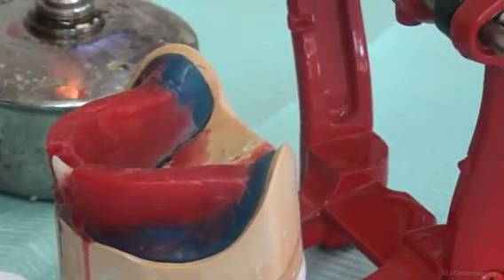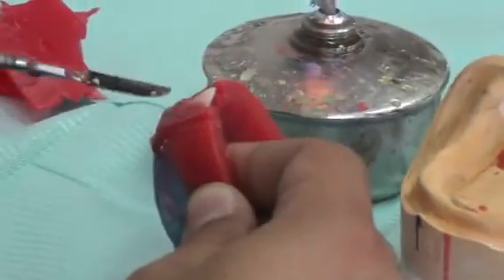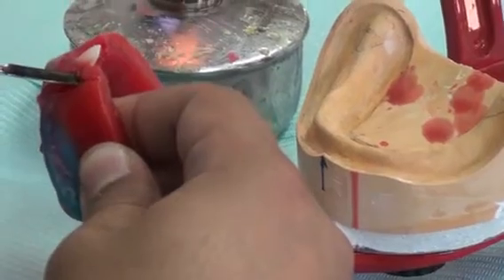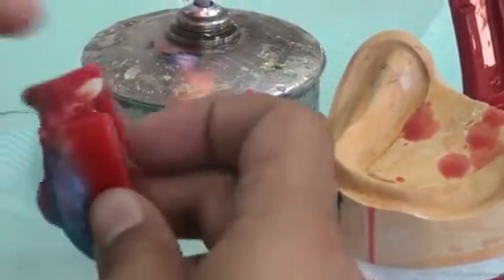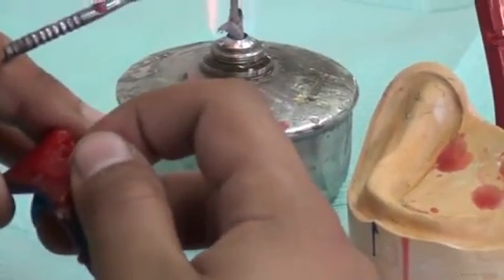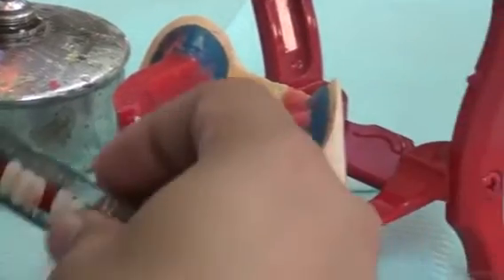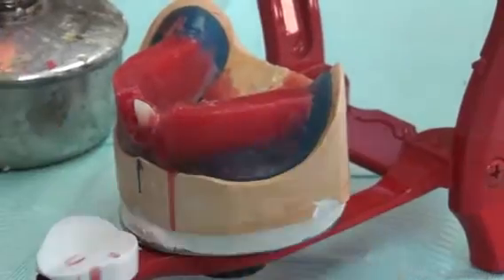Now we're going to add the second incisor, the lateral incisor. So once more we open a box, a bit shorter than the length of the tooth. And while working, we need to make sure that the tooth is stable in position. Then we melt the wax beneath the tooth. We're taking out the correct tooth. After we have removed the other central incisor, we just made the central incisor to ensure the midlines. Now we're adding the lateral incisor.